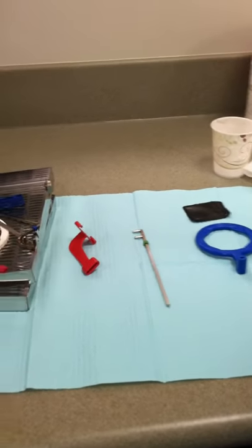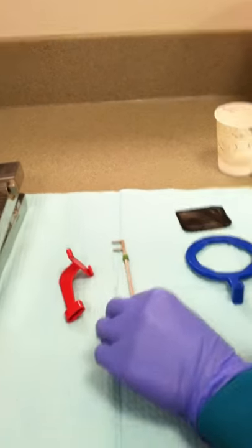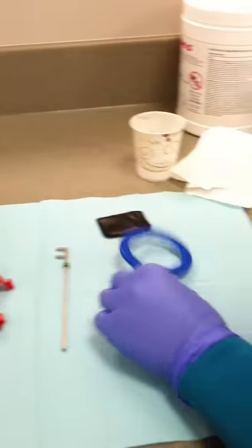For the premolar bite wing, the XCP consists of a horizontal bite block, a steel rod that lays flat, and a centered ring attachment.